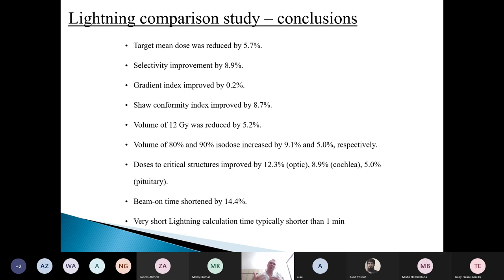He would calculate both options, but quite often for those particular patients, he would pick the manual one, because it's, for example, hard to tell, this is not important, the bottom of the tumor, the direction where you're going, where you can actually spill the dose. This is something hard to tell to the software. But otherwise, we are really using it for all patients.